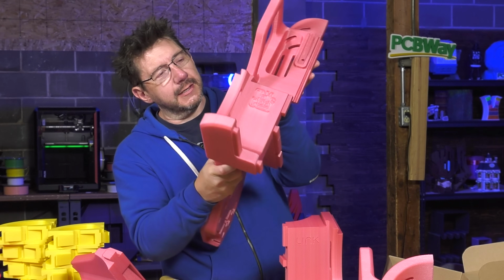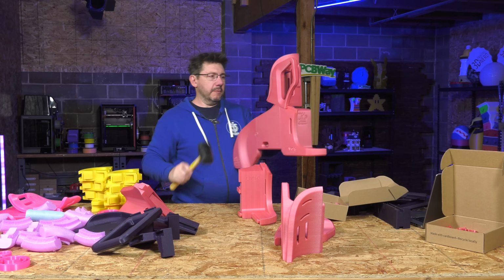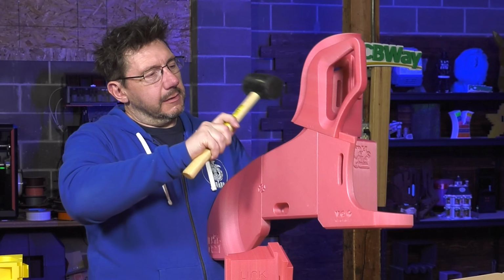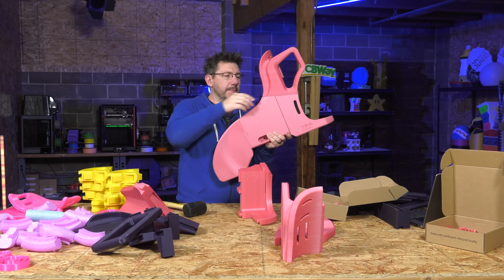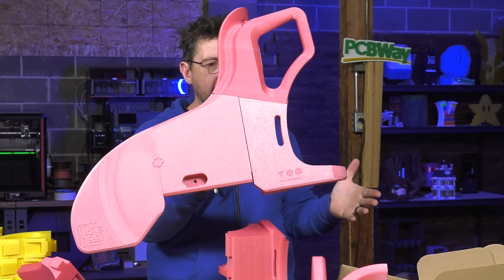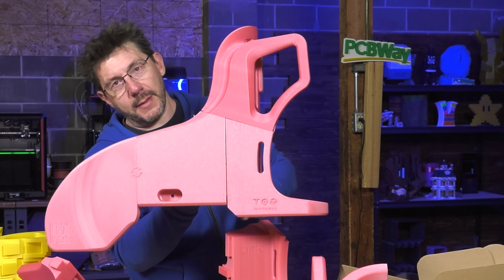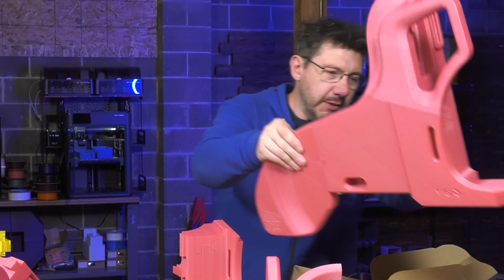Instructions state you tap lightly. So grab your mallet and just kind of, dang it. Well, I'm tapping lightly. Okay. Now this is half of your TMT. That's it, just like this. Be careful when you're tapping. And this holds it together. This holds everything together. It's got that dovetail right there. Now we can do the other side.